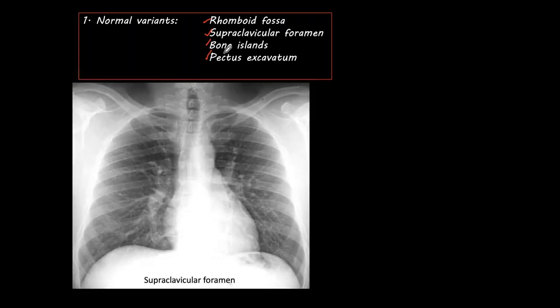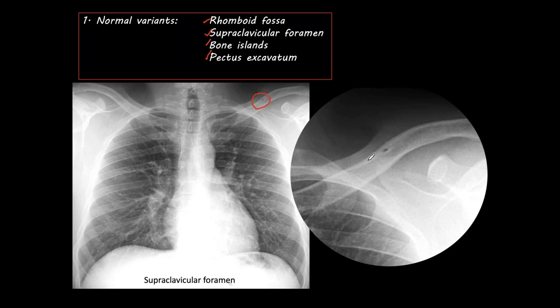It's a small hole with a sclerotic border and should not be confused with a real lesion. I know people have called it osteoid osteoma, but it shouldn't be — it's normal. I have even seen a case that was operated on because of this finding. So it's a supraclavicular foramen, which is not uncommon and should be distinguished from any pathological condition.